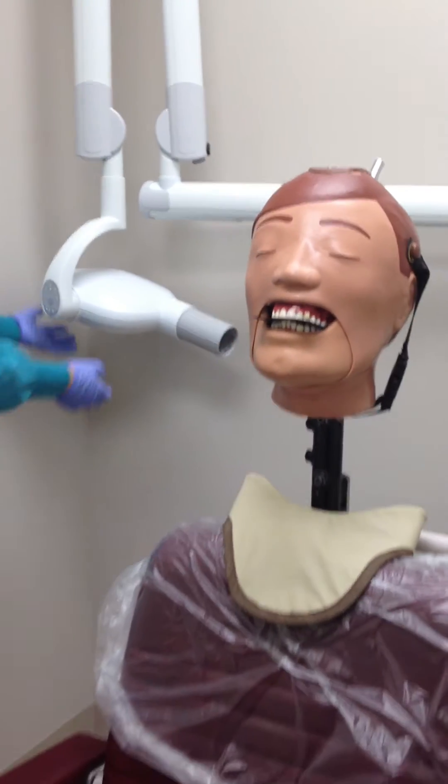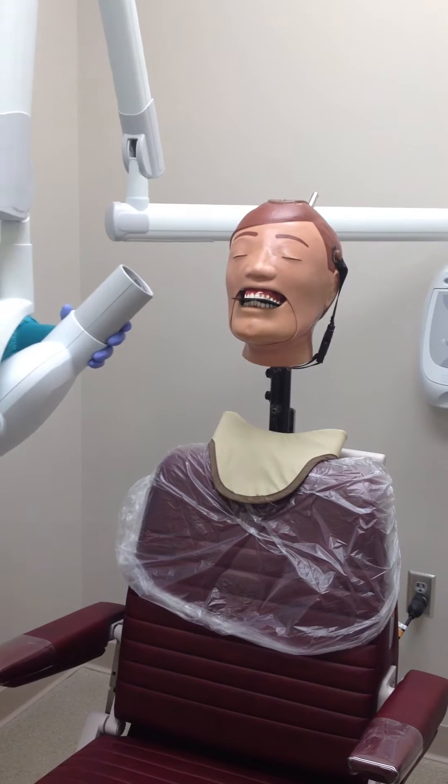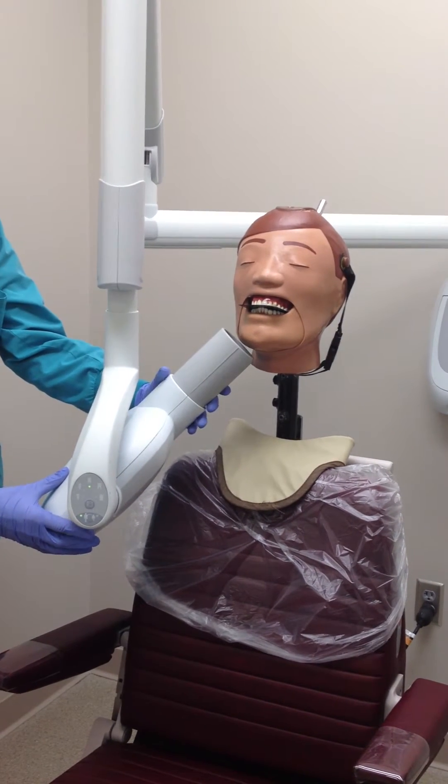The central ray is then aimed with a vertical angle of negative 50 degrees through the center of interest, normally the molar or premolar region. The PID is positioned with a horizontal angle of about 90 degrees.